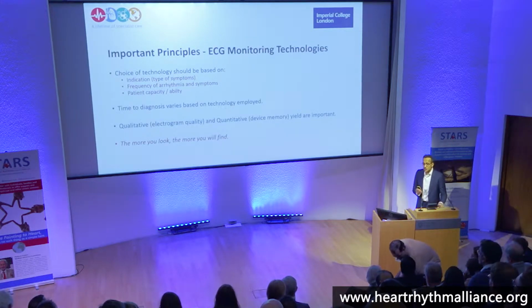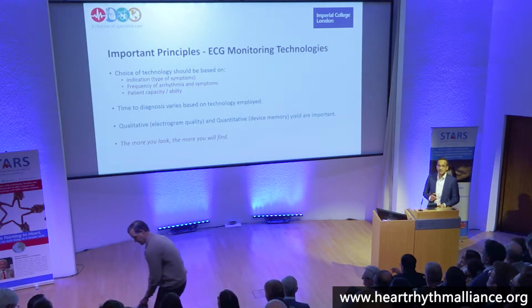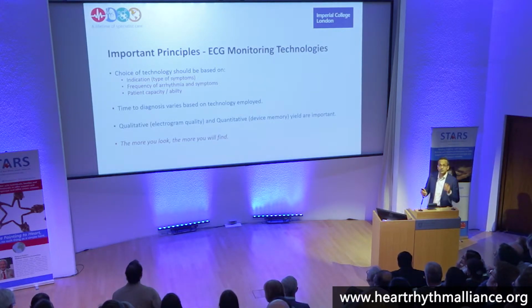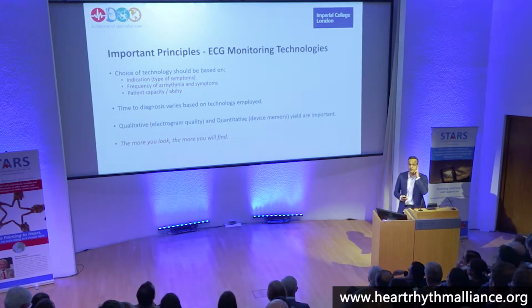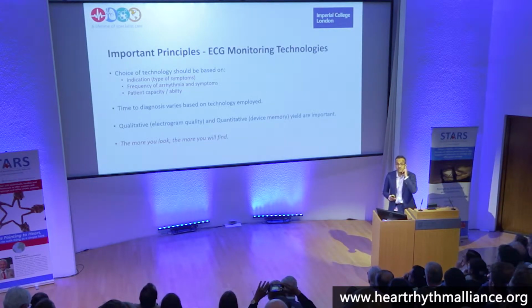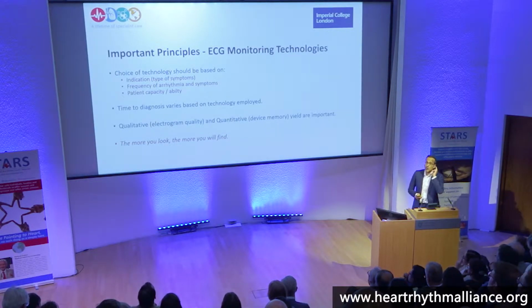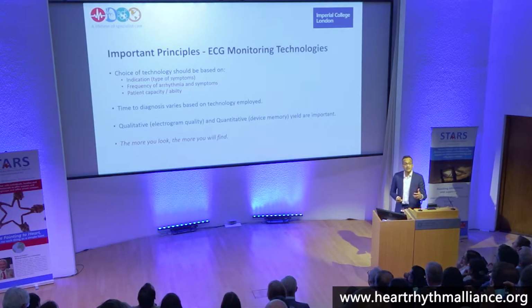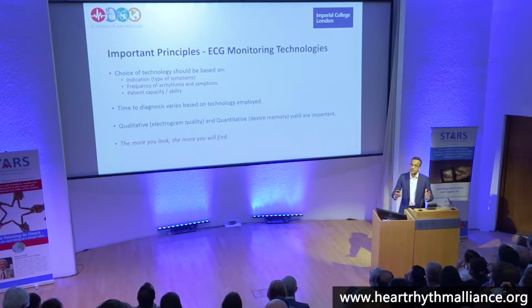So the choice of your monitoring technology would really depend on 3 main factors. The indication. Now here we're talking about syncope, so your patients are incapacitated, so it's very difficult for them to press a button or engage with the device. Okay, so that's important. Frequency of the arrhythmia and symptoms. Once they come into the emergency department, the likelihood of them being syncopal again within a short time frame is high, so short monitors might suffice.